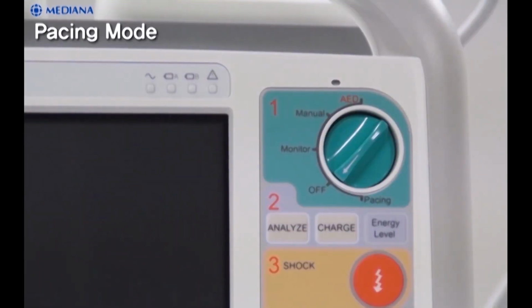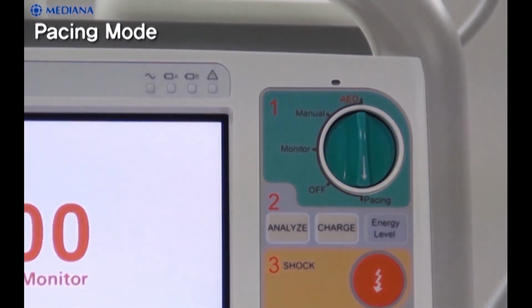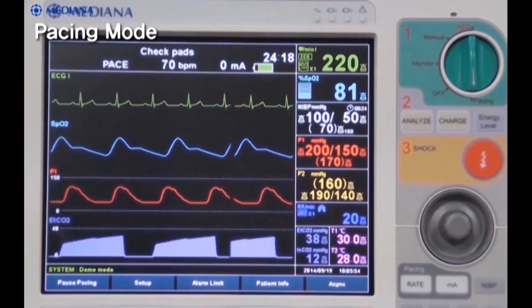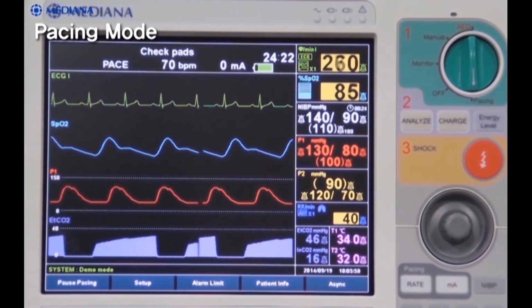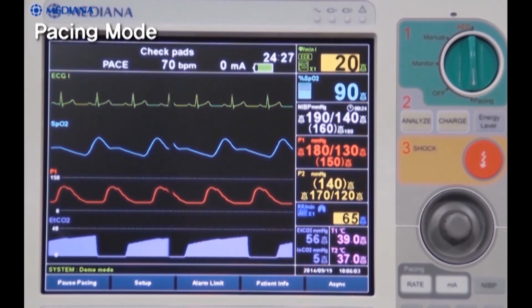Let's see how to use the pacing mode. First, select the pacing mode of the D500 by rotating the mode select knob. When the pacing mode of the defibrillator monitor is activated normally, the pace rate and current value will be displayed on the top of the screen, and other parameter information will be displayed.